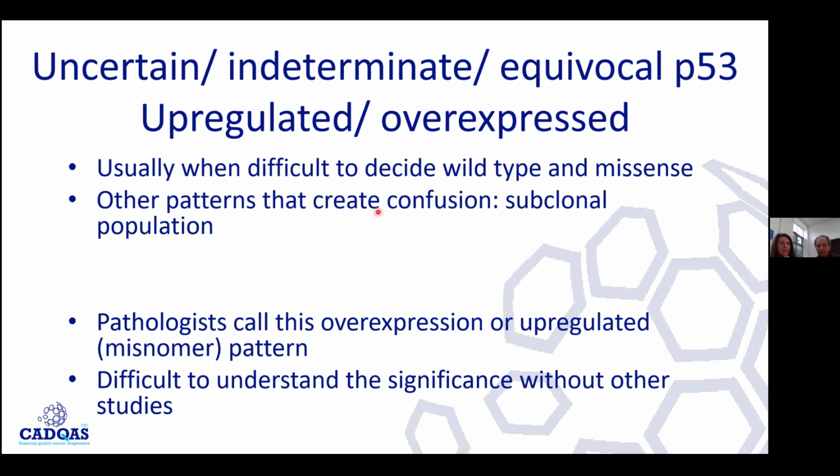And then, of course, now the question is, and we show some examples that are in between, there are some patterns that are difficult to classify, so we cannot be sure as pathologists looking at an IHC slide. There are two main situations. One of them is when we have overexpression of P53, but we're not sure if it's a mutated pattern. Sometimes we see a lot of staining, but not quite all of the cells staining, and maybe some variation in staining intensity. And you think, is this overexpression because of just functional overexpression, or is this mutation? That's difficult sometimes, I agree.